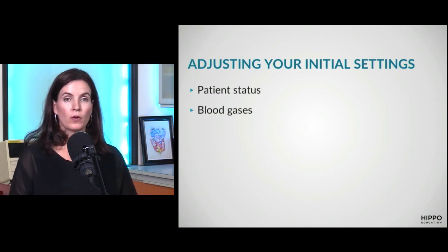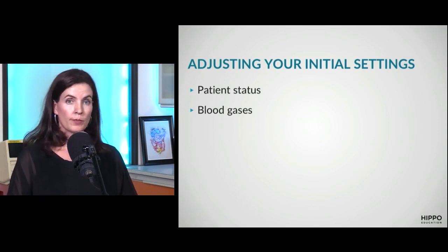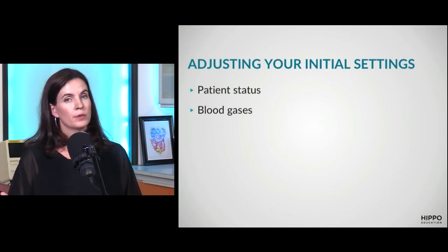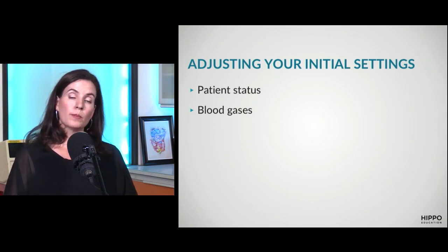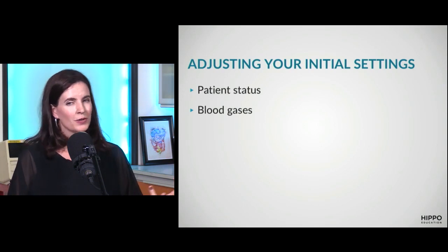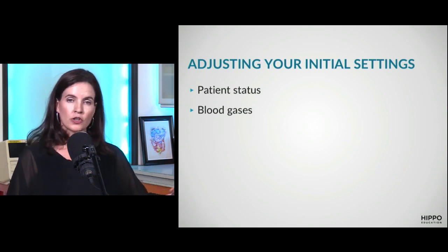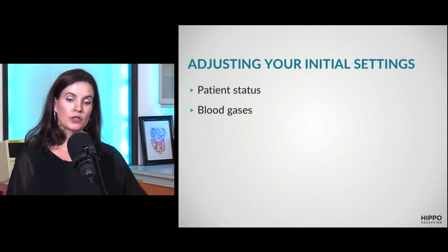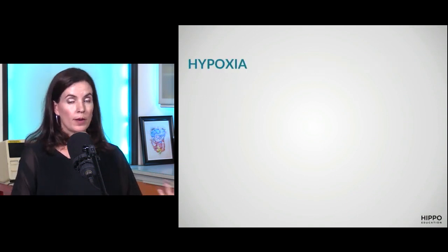Are they comfortable? Is their SAT okay? Do they look air hungry? Maybe you need to turn up the flow. But you want a comfortable patient with decent vital signs lying in the bed. And then you're getting blood gases. Usually I'll get my first set maybe 15 minutes after I've intubated. And then depending on how sick the patient is, maybe every hour or two after that to continue adjusting as the patient changes.